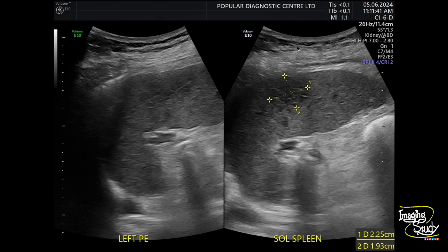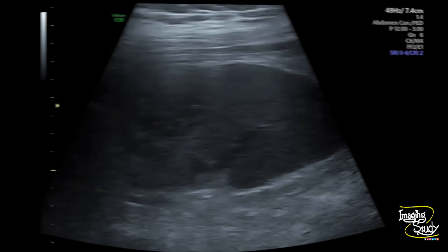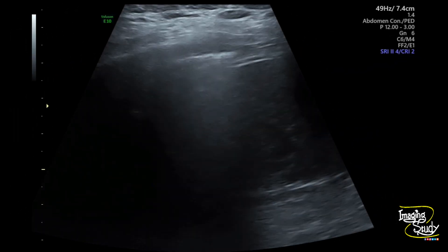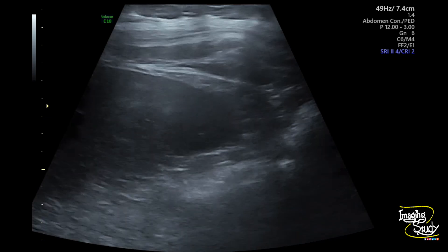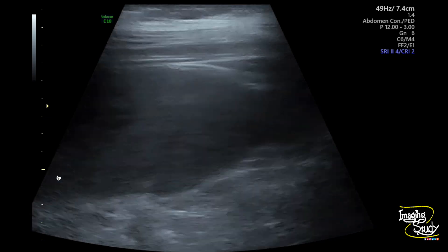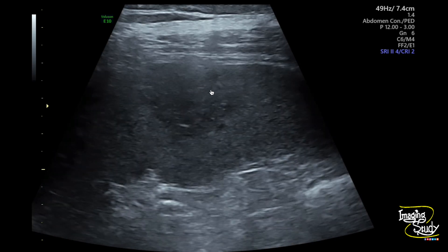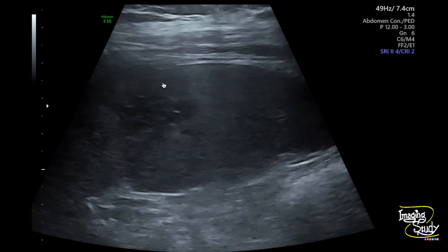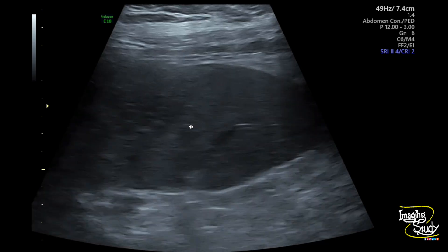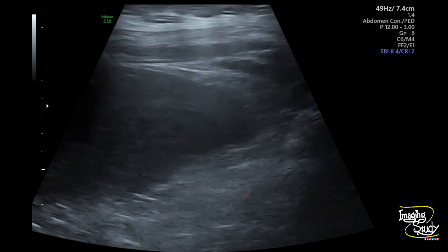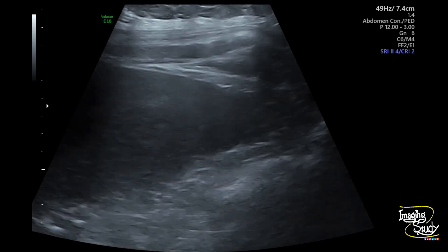As this structure is superficial, let's use a linear transducer. Here's the linear transducer view. You can see the hypoechoic area with the internal bright band sign. This image may not be so clear, so we need to change the contrast a little bit.